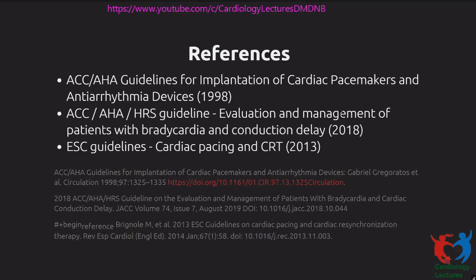His bundle pacing, I would say, is less invasive than left bundle pacing, which involves putting a lead deep into the septum, where we are still not fully aware of all the long-term risks that can happen. We already know of some small risks of perforating into the LV endocardially, producing thromboembolic complications from there, producing injury to the septal branches of the coronary arteries and things like that. And it definitely seems to have a slightly higher risk of dislodgement.